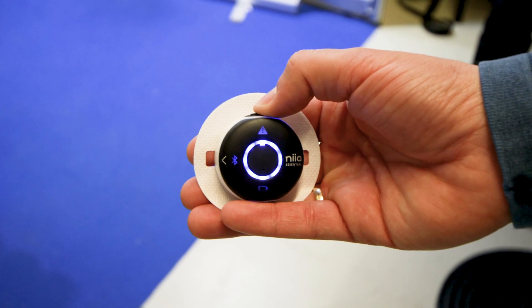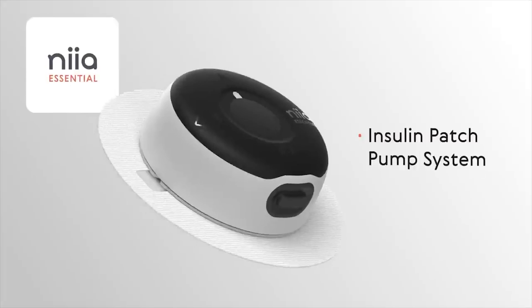Hey, I'm Justin. Welcome to Diabet Tech. I am checking out one of the coolest new pieces of tech in the diabetes field. This is a tubeless insulin pump that is semi-reusable. This is the Nia Essential.